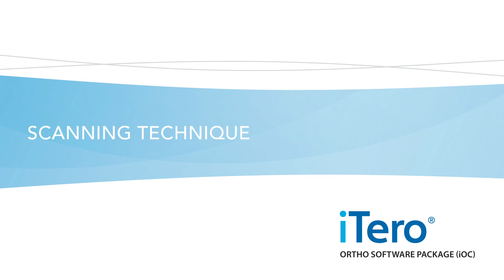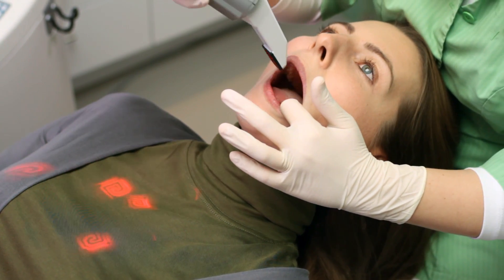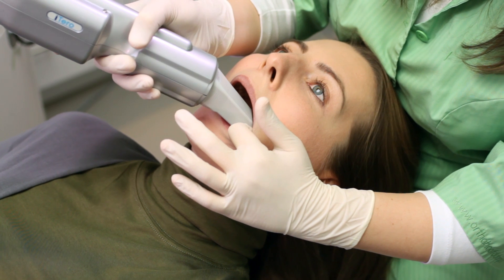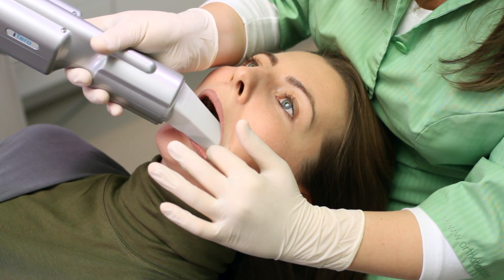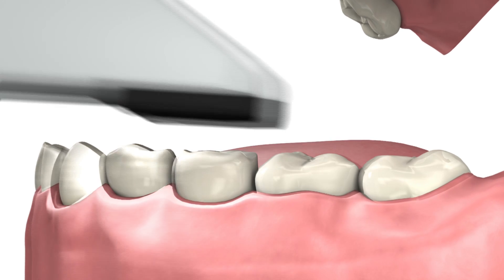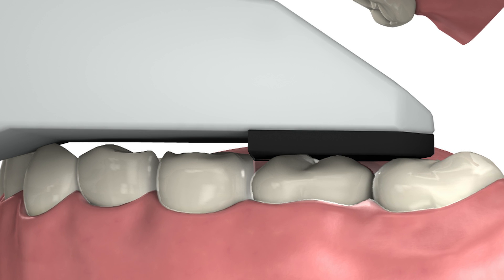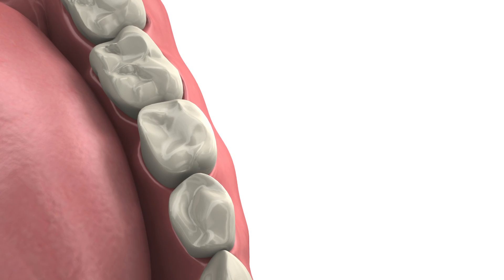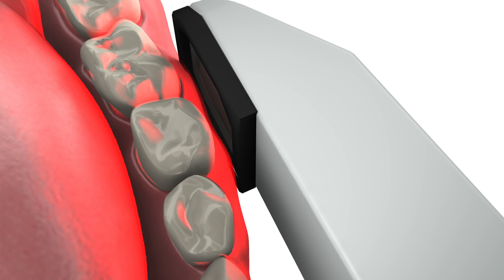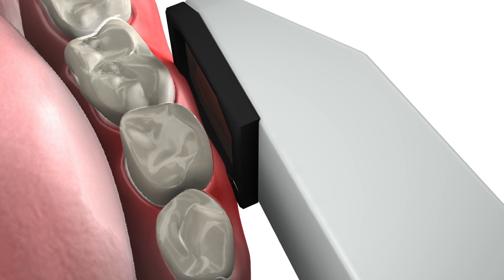Scanning technique. When approaching the patient for a scan, make sure you don't catch the patient's lip or cheek with the scanner. Instead, just gently pull the cheek aside and position the scanning head. The preferred method of scanning is to have the scanner touch the tooth surface, which will not cause the patient any discomfort. When manoeuvring, it's very important not to come into contact with the soft tissues, as this may cause discomfort.